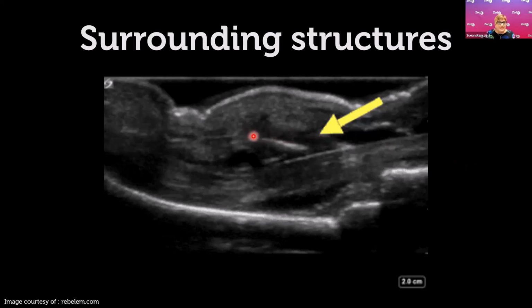In this image, we can see a hyperechoic foreign body here, and it's coming very, very close to the tendon. And it may even be interfering with the paratenon here. This patient complained of right hand pain after she got a large fragment of wooden cooking spoon that penetrated her right palm approximately a week ago. She reported immediately removing the splinter, but was prompted to go to the emergency department after her pain gradually increased. And she also noticed that her ability to flex and extend her fourth finger was starting to be affected.